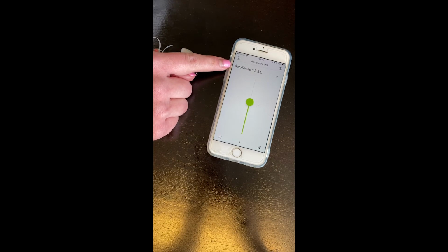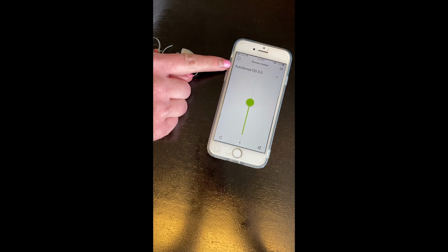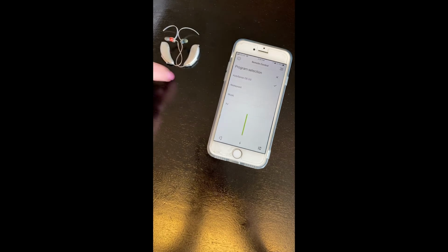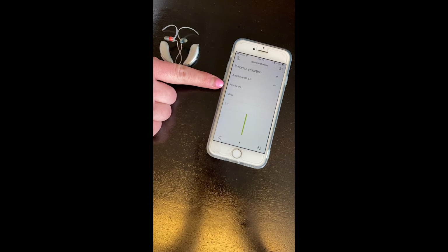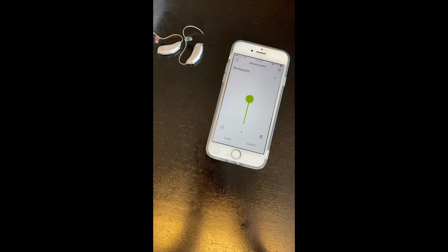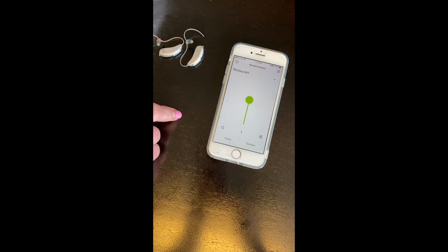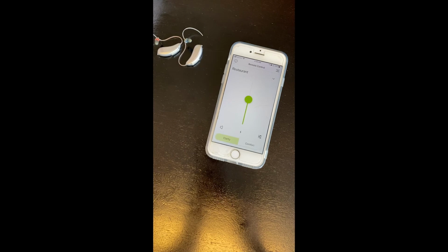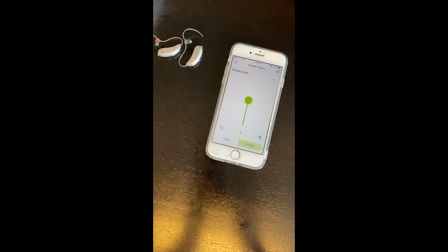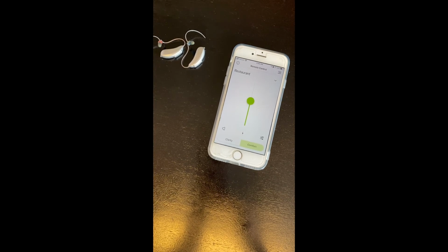Up here you can see it says Auto Sense 3.0. These hearing aids are really smart. They know what situation you're in, so this might change every once in a while. But if you click on that, you can adjust the program. So if you're in a restaurant and there's a lot of noise, you can click restaurant and it'll help take out some of that background noise for you. You can always press clarity or comfort down here too. So clarity is going to help you hear a little bit better in that background noise. And then comfort is going to give you a little more comfort so that you're not overwhelmed by all the noise that is going on. That is going to take away some of the clarity, but it will give you that comfort.